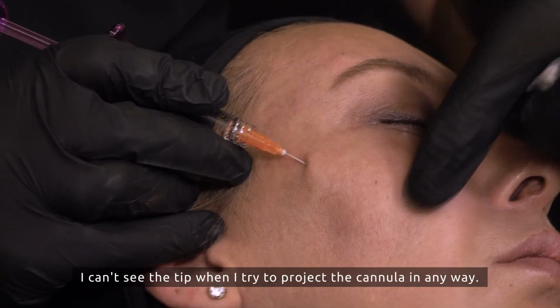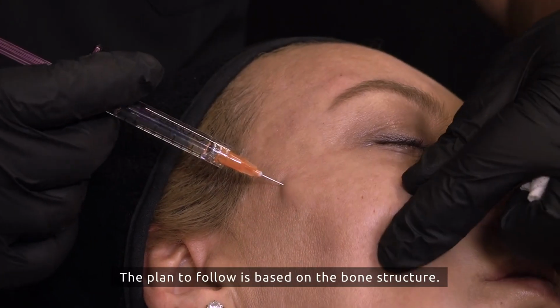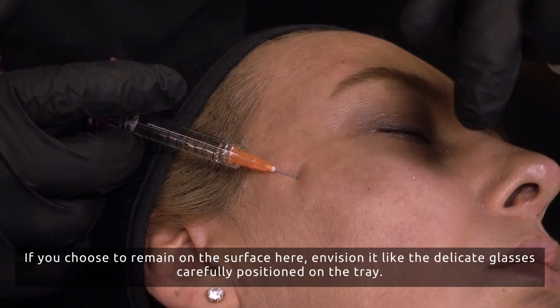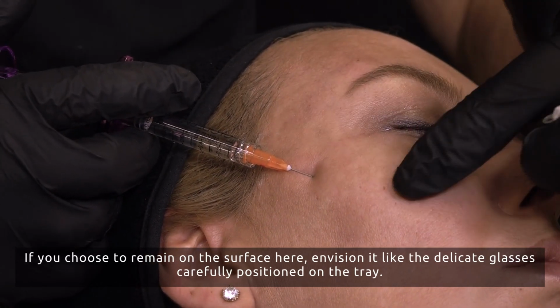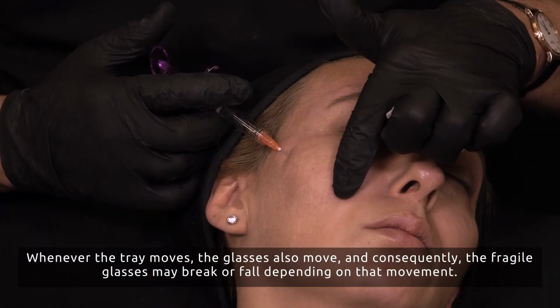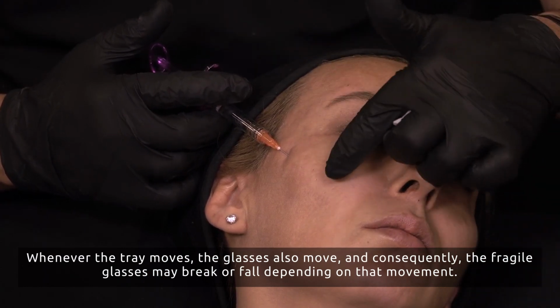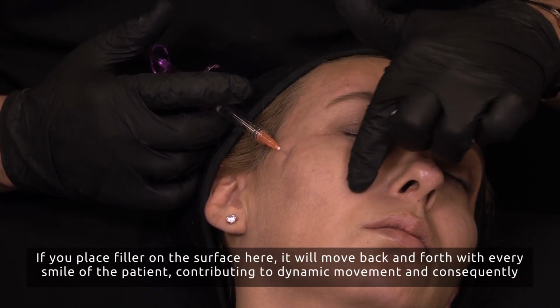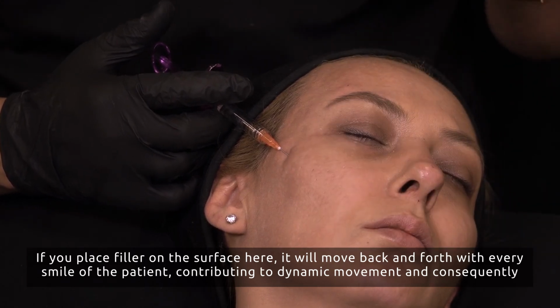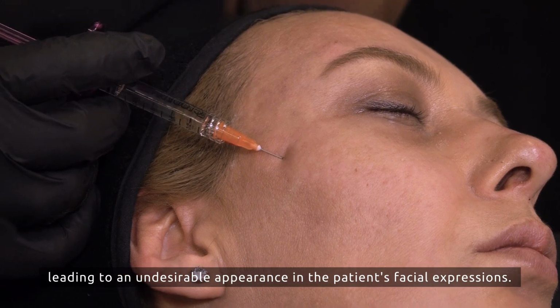I can't see the tip when I try to project the cannula in any way. The plan to follow is based on the bone structure. If you choose to remain on the surface here, envision it like delicate glasses carefully positioned on a tray. Whenever the tray moves, the glasses also move, and consequently, the fragile glasses may break or fall depending on that movement. If you place filler on the surface here, it will move back and forth with every smile of the patient, contributing to dynamic movement and consequently leading to an undesirable appearance in the patient's facial expressions.